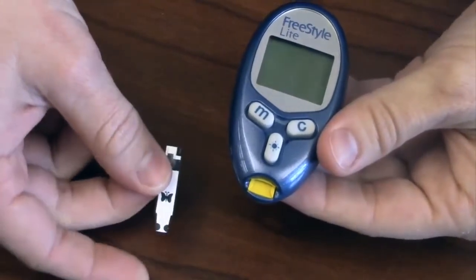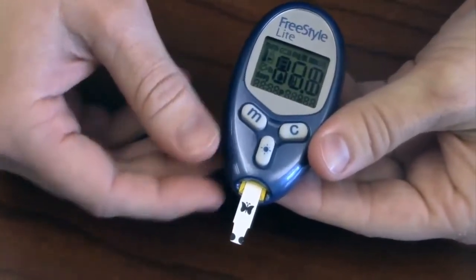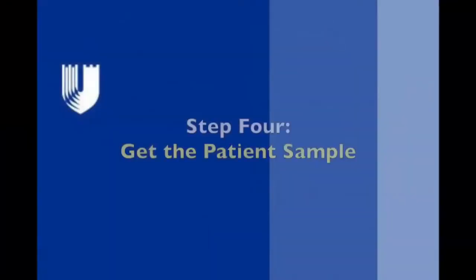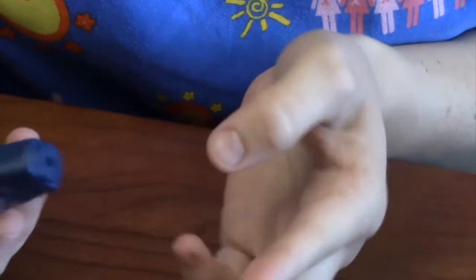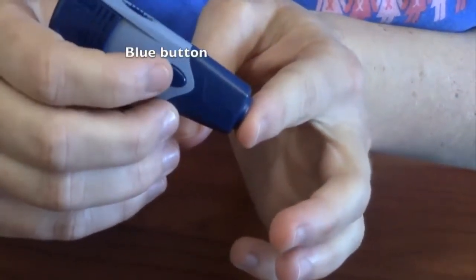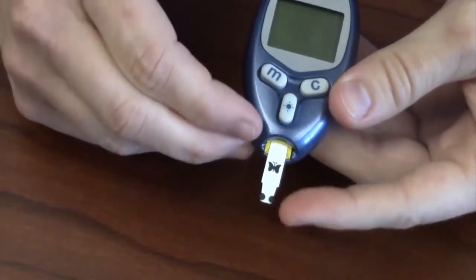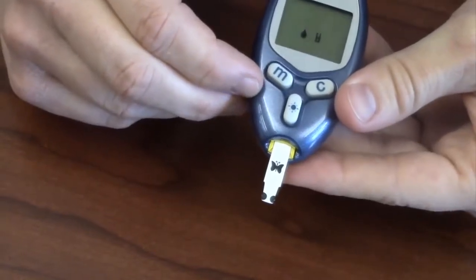When you're ready to get a blood glucose reading, the first thing you'll do is insert a test strip — note that it goes butterfly side up. When the meter is ready to be used, the little drop of blood icon will be flashing. Apply the lancing device against the skin and press the blue button to release the needle. Apply the blood sample to the black circles on the side of the test strip — you can use either side. Once the blood has been applied, within seconds a test result will show up.